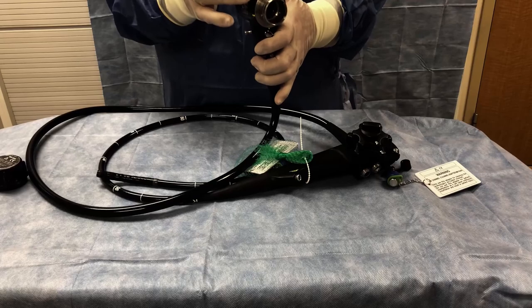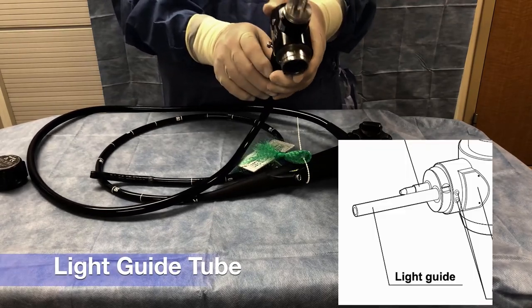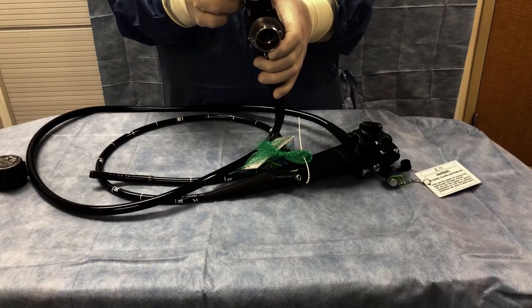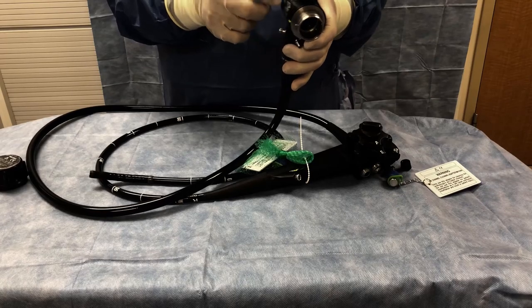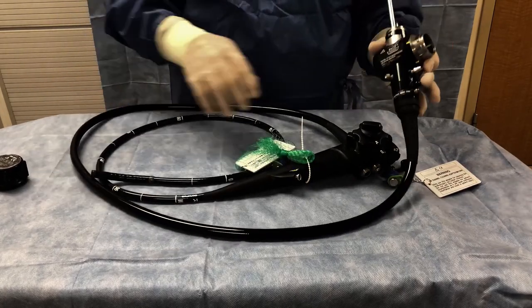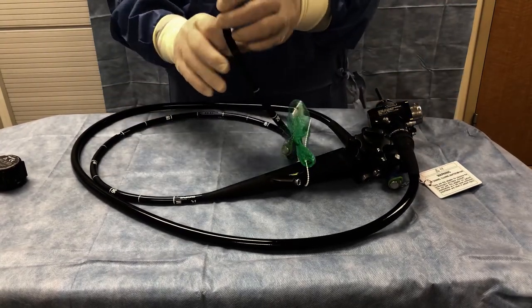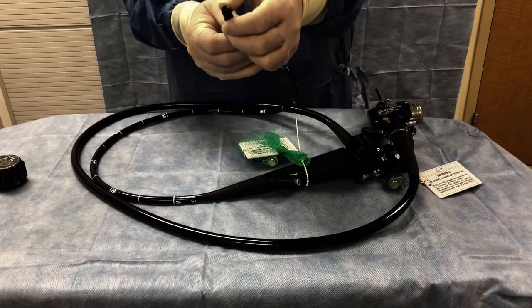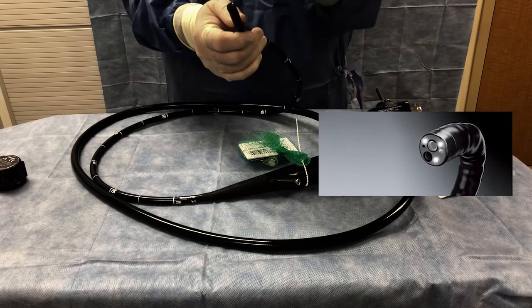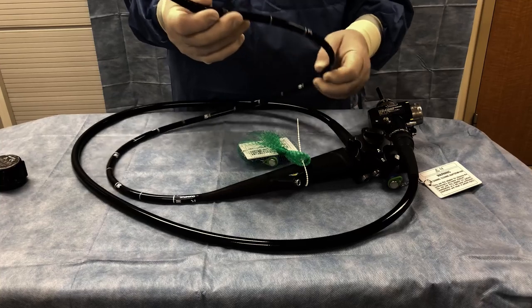This long tube is called the light guide tube. It has fiber optics in it that go down through the light guide channel, through the control handle, and down to the tip of the scope. There are two what I call headlights on the scope, and those two headlights illuminate whatever we are trying to see inside the body, because it is pretty dark in there.